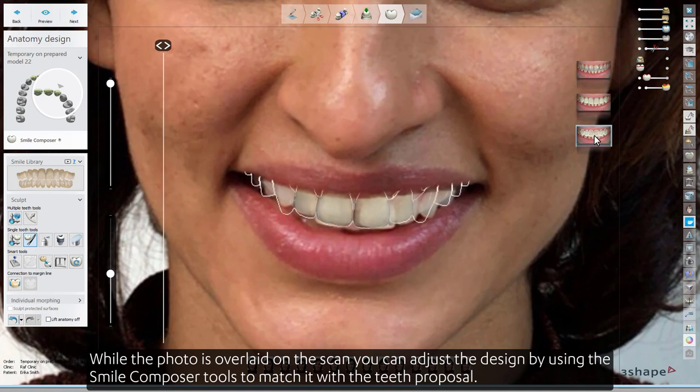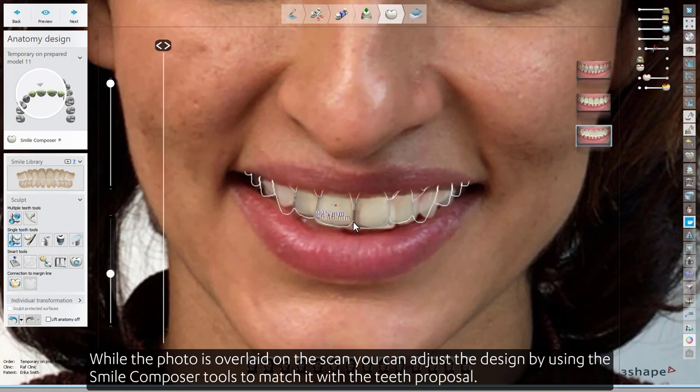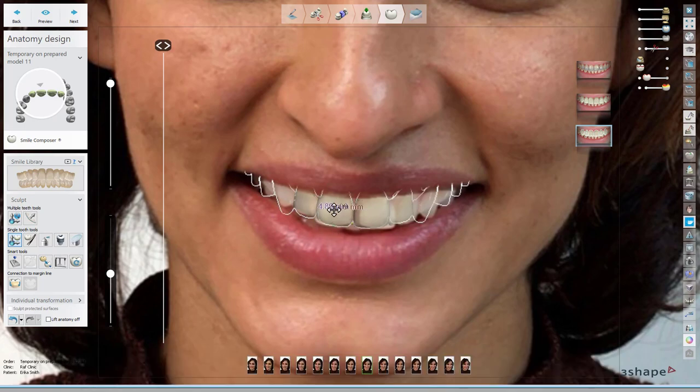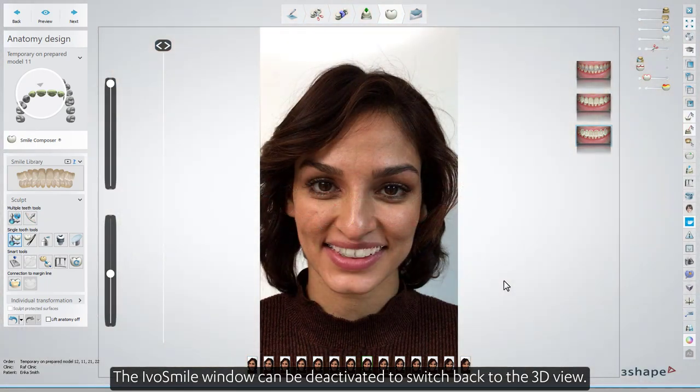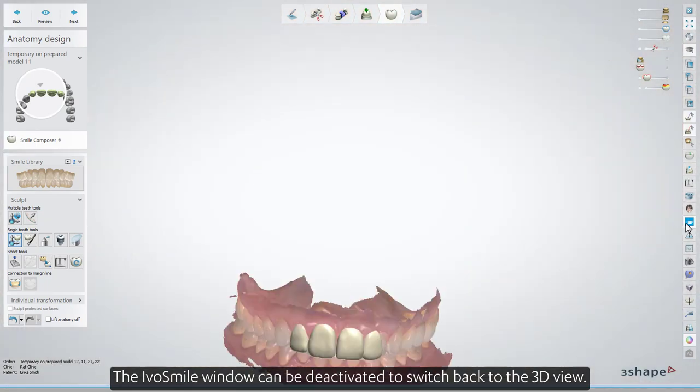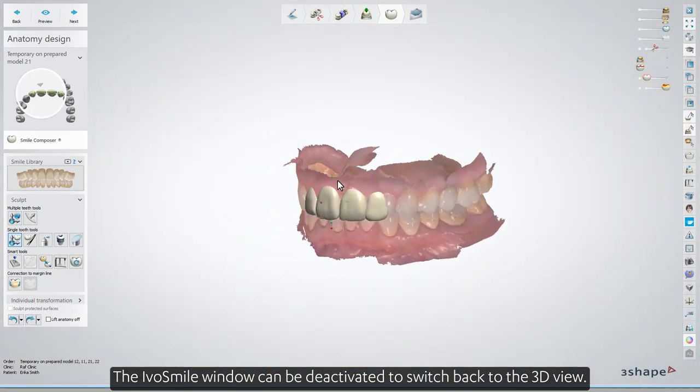While the photo is overlaid on the scan, you can adjust the design by using the Smile Composer tools to match it with the teeth proposal. The IvoSmile window can be deactivated to switch back to the 3D view.